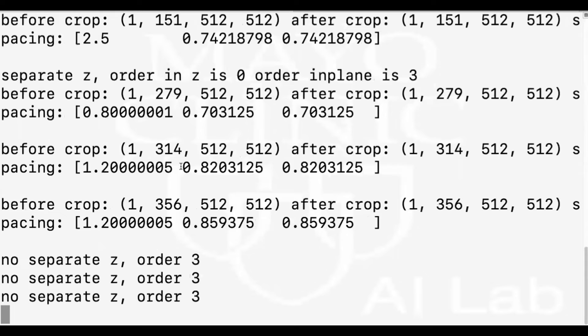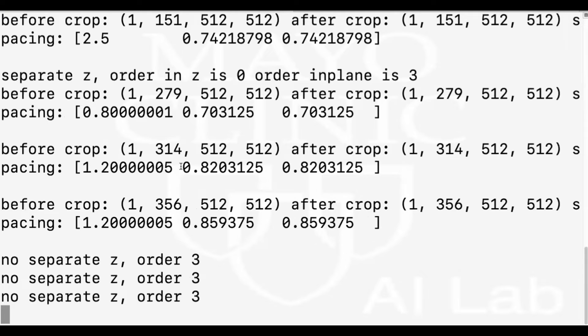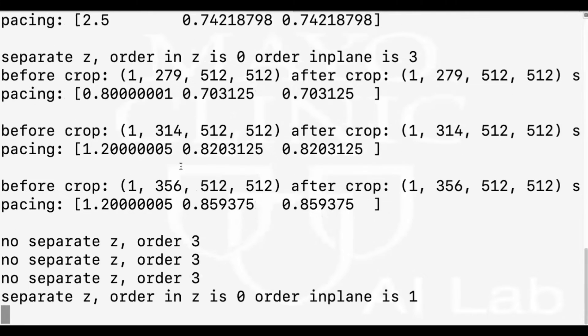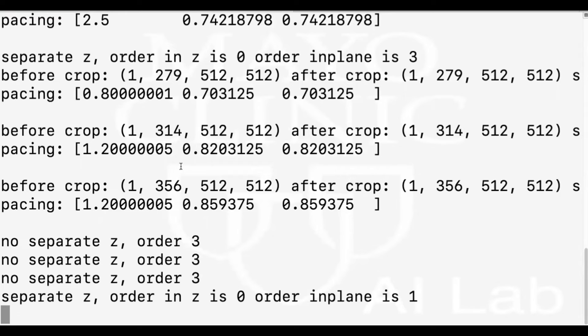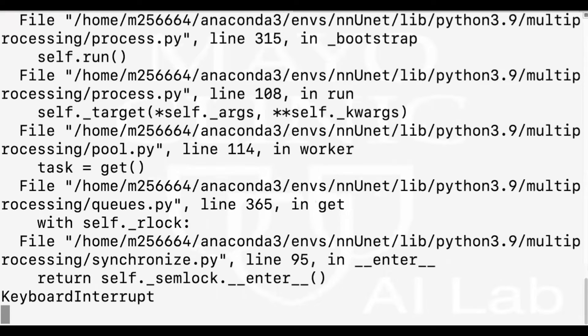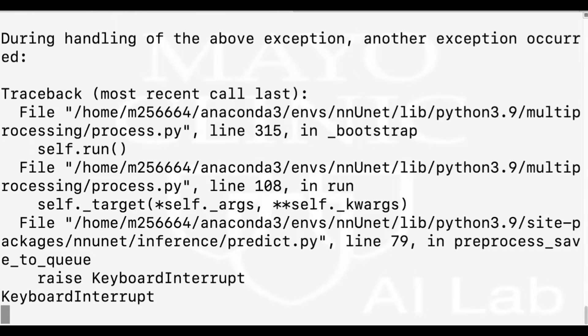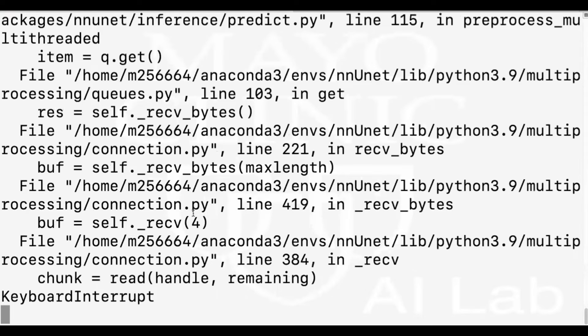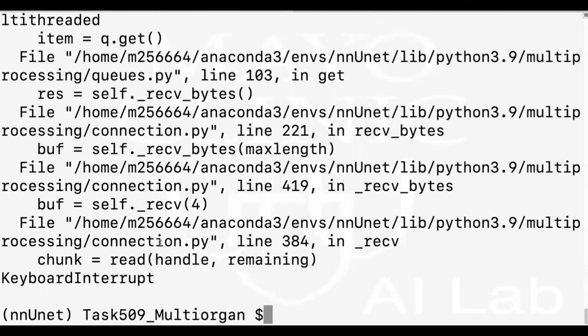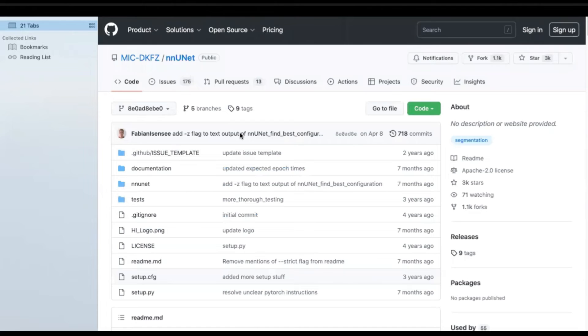Now nnU-Net is predicting. However, because it's time consuming, I will drop the prediction process. And I already did that for all test images and I have them in my folder. So I think that's enough to show how it works.